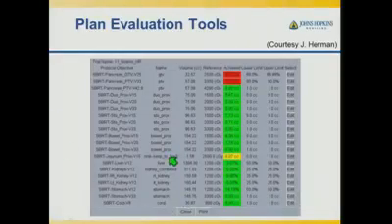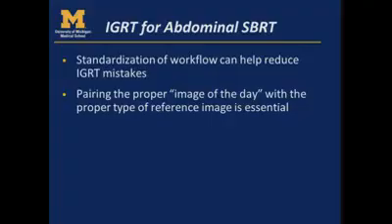And it's always useful to have really good plan evaluation tools. This is an example of a tool in their planning system that works like a scorecard for all of the many dose objectives that they have. Tools like this are really helpful for evaluating SBRT and IMRT plans.